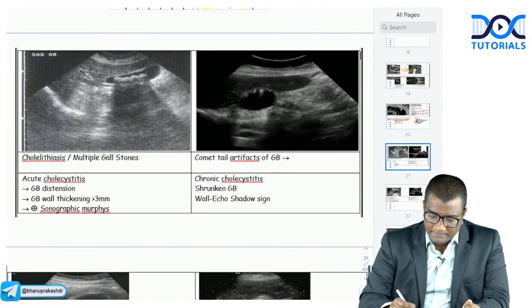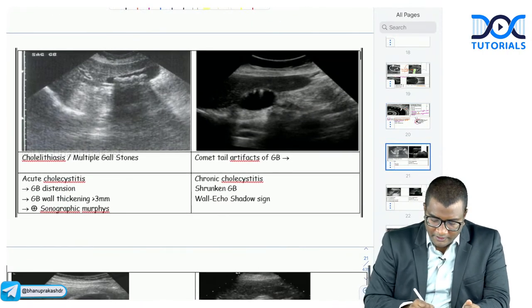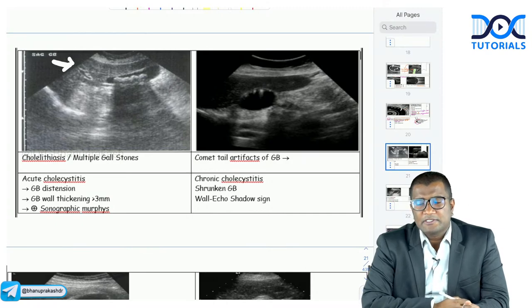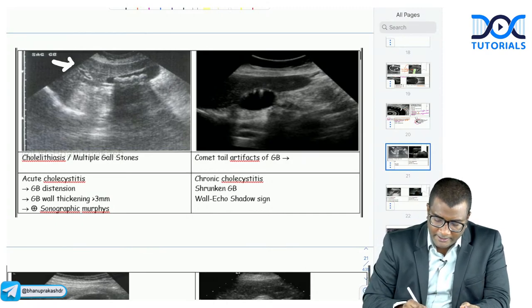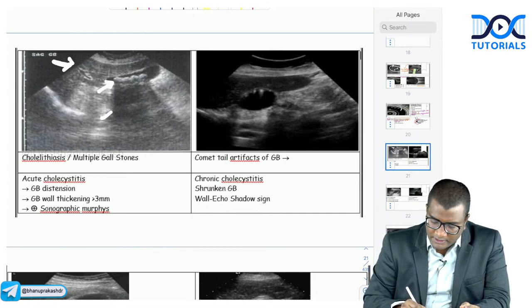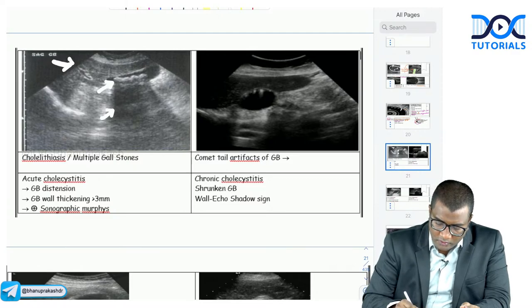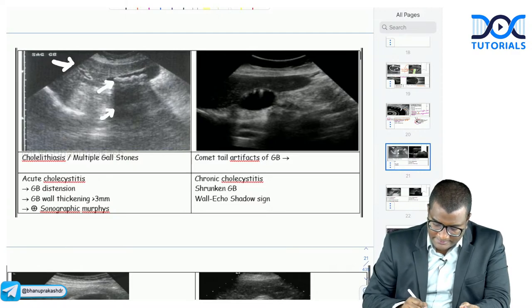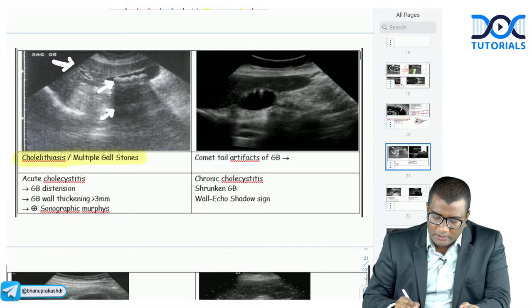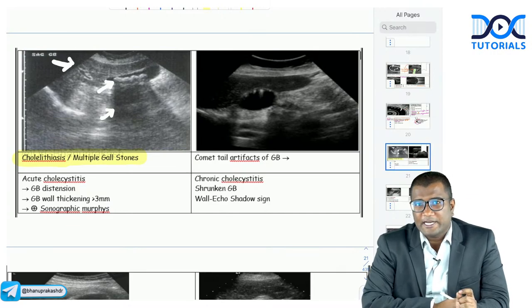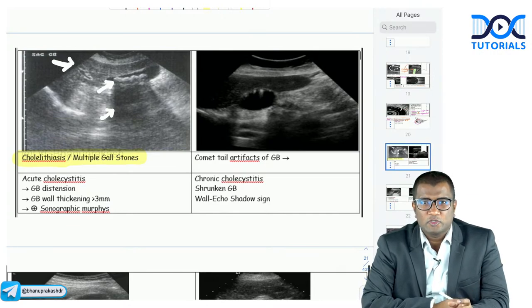Looking at gallbladder images: a hyperechoic area with posterior acoustic shadowing inside the gallbladder represents cholelithiasis or gallstones. Shadow means stone — whenever you see a hyperechoic area with a shadow, it is a calculus or gallstone.